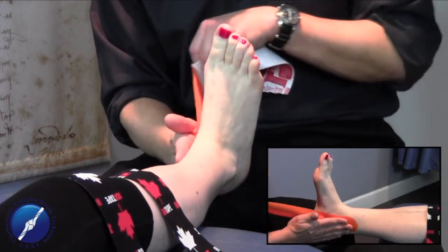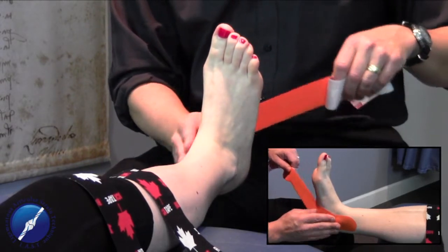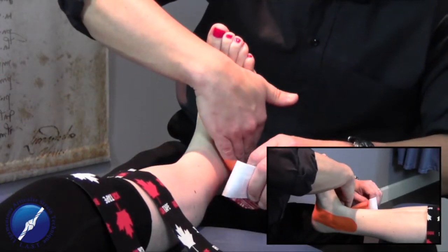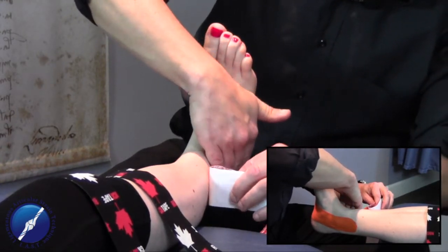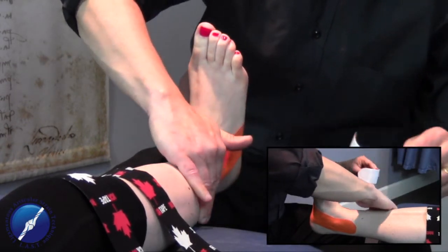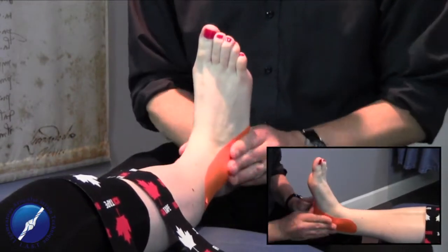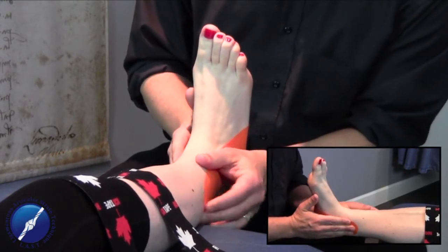We slowly come around the medial malleolus and provide a little bit of stretch — you can do a hundred percent stretch, but we're going to come back to about fifty percent. It's going to wrap right around the lateral aspect. I keep the stretch on as we go over the lateral malleolus. Where we come up onto the skin, I release the stretch and just tack the tape down, then give it a little rub to activate the adhesive.